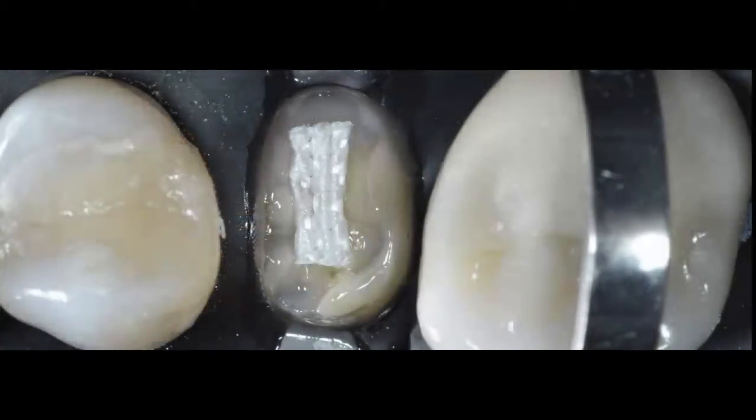When I look at the photo, you look at these blow up photos, I think it would have been better for me to cut the fiber maybe a little bit longer. The tooth, I did have maybe a millimeter to a millimeter and a half of tooth beyond the gingival margin. You can see my clamps, and you can see the amount of tooth structure beyond that gingival margin. So I felt comfortable that I was applying my fiber at the right level.